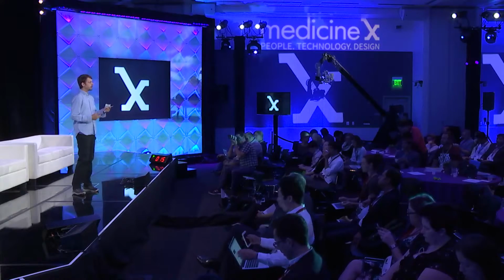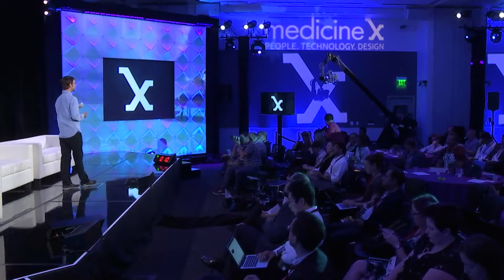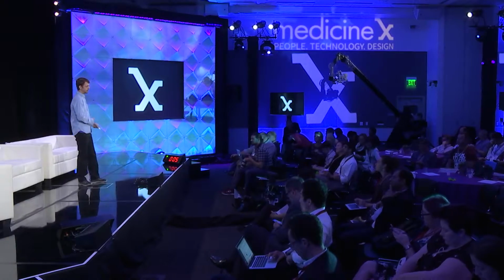And so another topic I want to touch on very briefly is security. We're intimately connected to these devices, and they are on a hostile network. They were not designed to be on a hostile network. Everyone assumed that this device is going to sit on your hip, it's going to sit in your chest, and it's not going to be connected to the internet. Well, that's not true today. The first thing that I did when I got control was to put both sets of my devices on the internet.